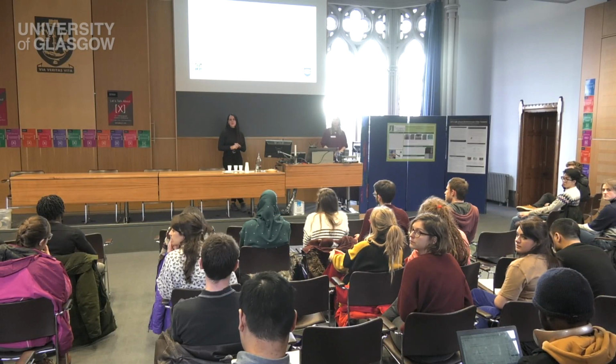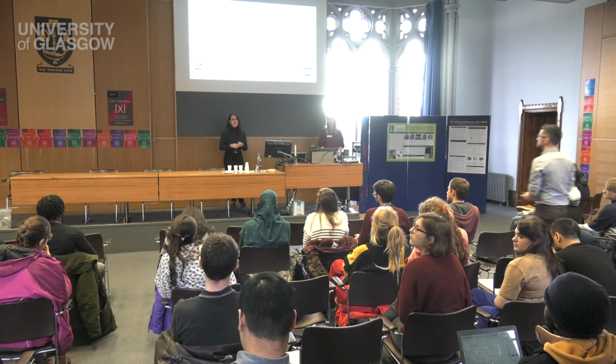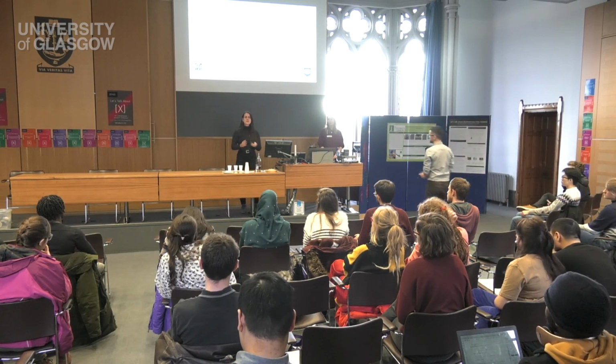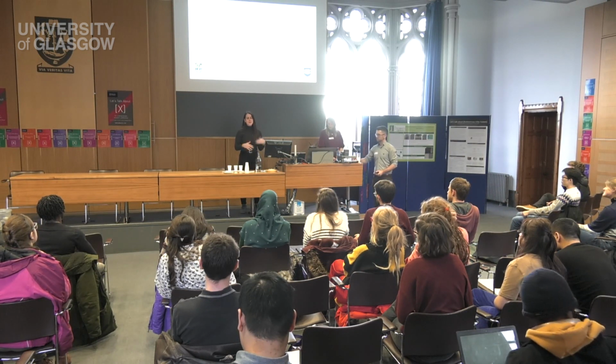And the second audience question is, are there still some people that this won't help? For example, if they can't hold their breath for that long? Yeah, so there's some things that you can do to kind of compensate for that. So when you're setting up a scan and the patient's in the scanner, there's some things you can reduce, usually with a trade-off in image quality. So you slightly give up a little bit of your resolution or a little bit of the diagnostic value of it to shorten the length of the breath hold time there.